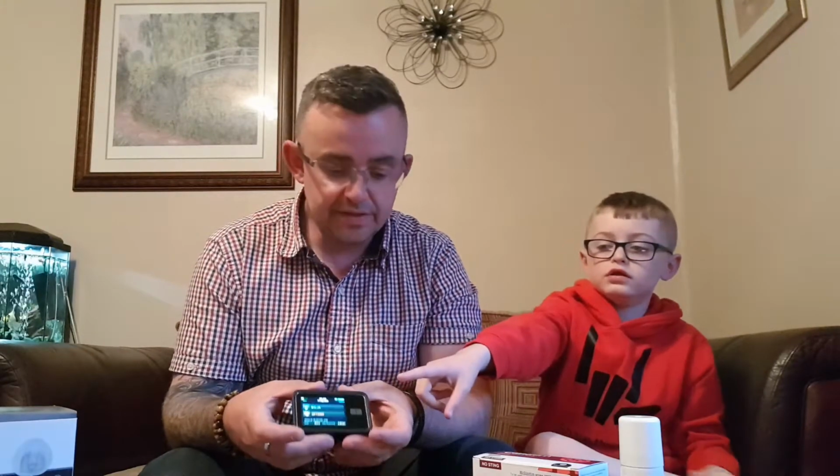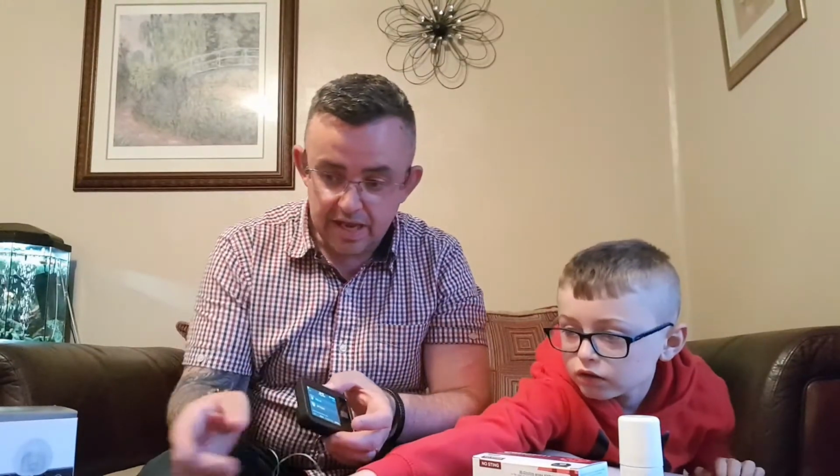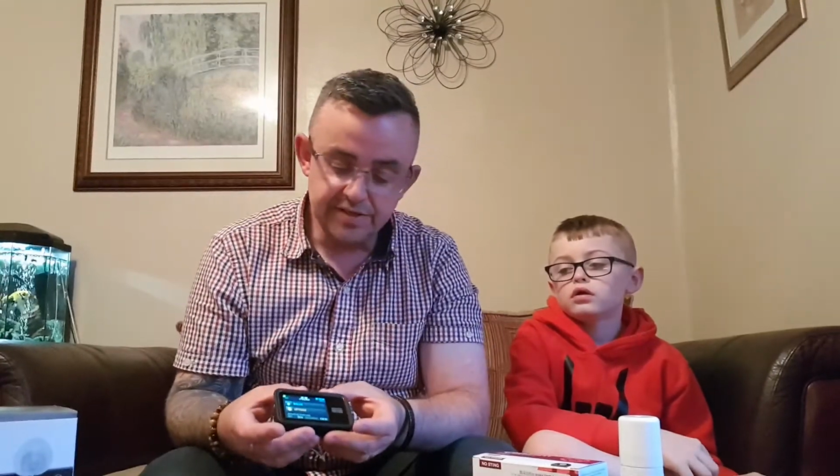So resume insulin. We want to resume insulin because it's going to carry on delivering my basal. I call it my night time insulin because it's a habit from multiple daily injections, but it is all the same insulin. Is that 3 millilitres? Yes, that's a 3 millilitre cartridge. It holds 3 ml. So that's all done now.